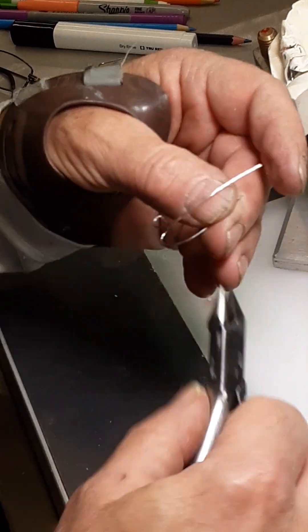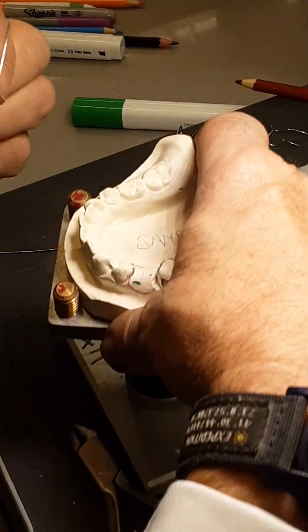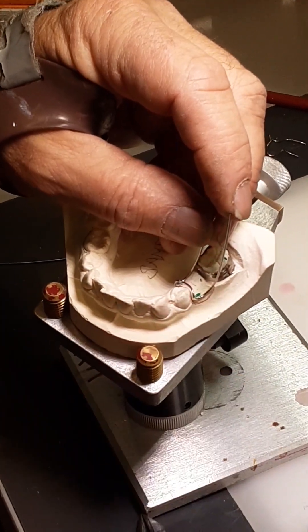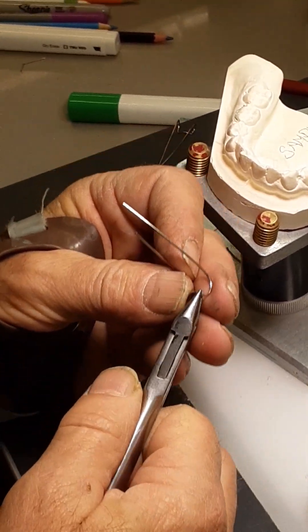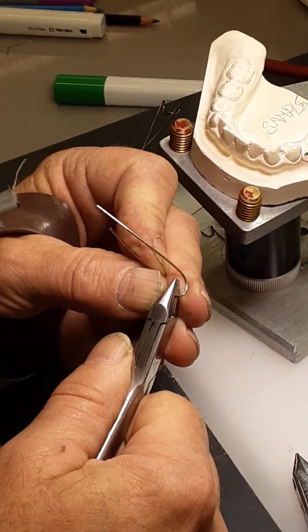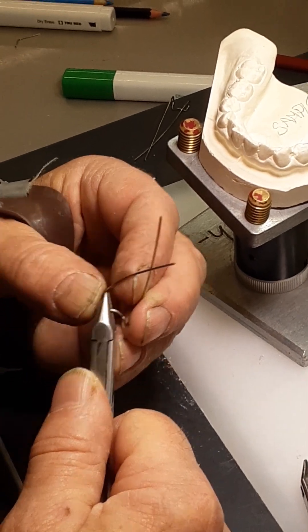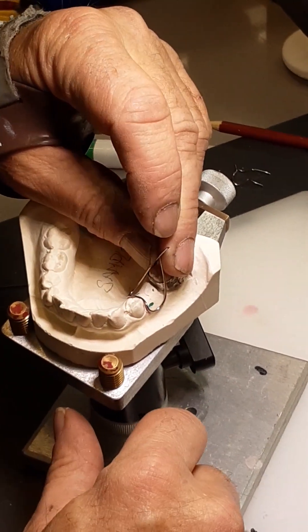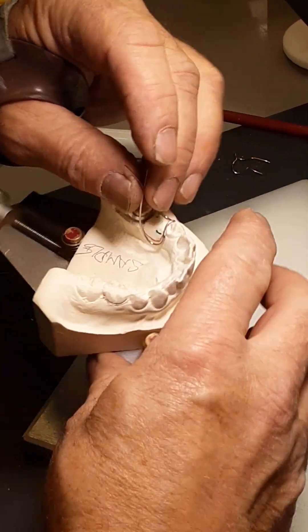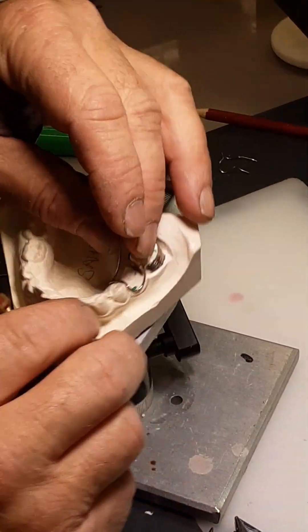Let me just straighten this out. Now the next thing I'm going to do is open up these 90-degree corners. This wire will not fit onto the model right now because of those 90-degree corners. I'm going to open those up by putting the square beak of the plier inside the 90-degree corner and squeezing just a bit — just enough so that the wire is going to fit over the ridge without interfering with it. I want the loops to come up so they just reach the mesial of the band.